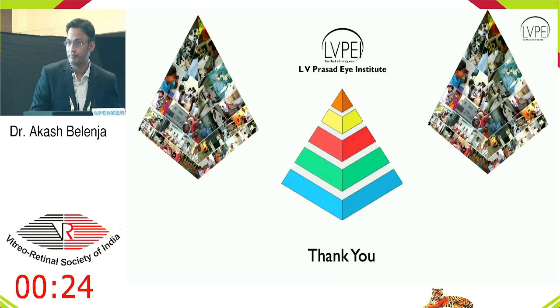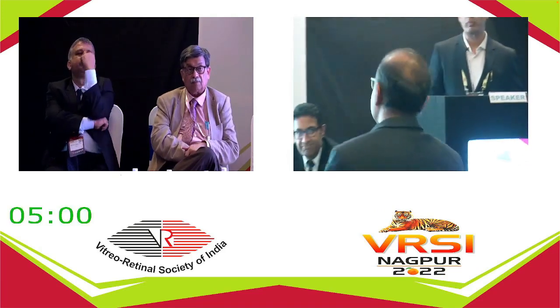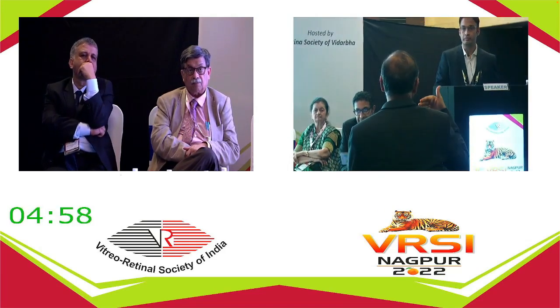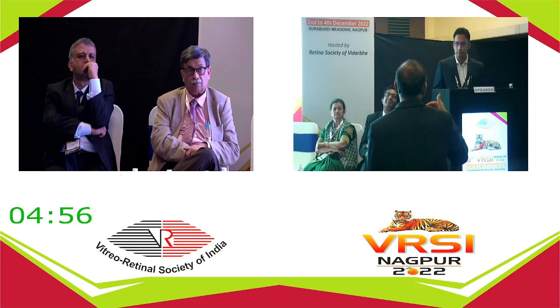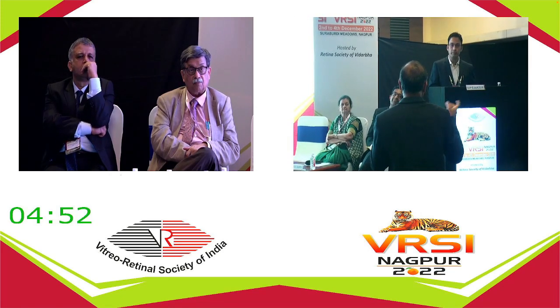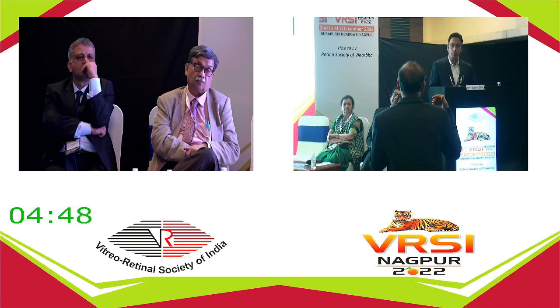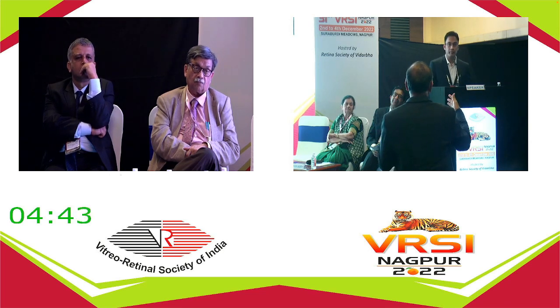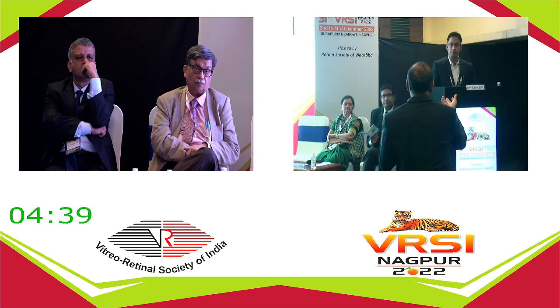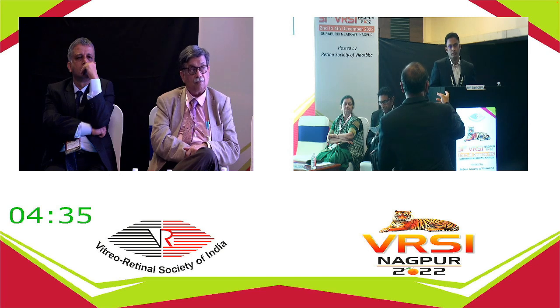Thank you. Excellent outcome, Akash. Now the question to you is, because both have a good indentation effect, right? Upper indentation, and you used a convex buckle. You used an imbrication technique, and over and above that, a 240. Now, somewhere at the back of my mind, would it cause an undue, very high internal indentation to the traction pole, if that's the desired endpoint you had in mind? So how are you going to titrate with the three variables which you're going to employ in this particular kit?